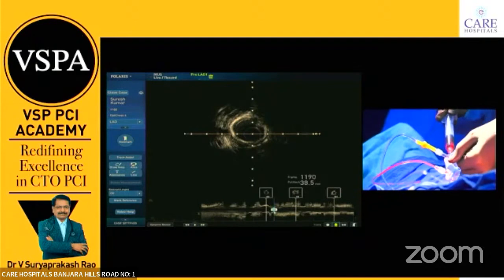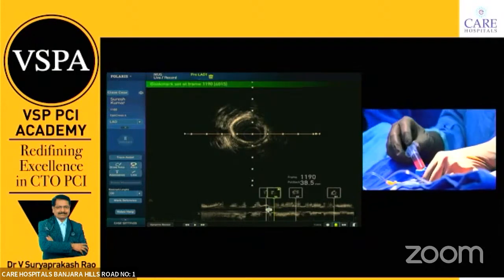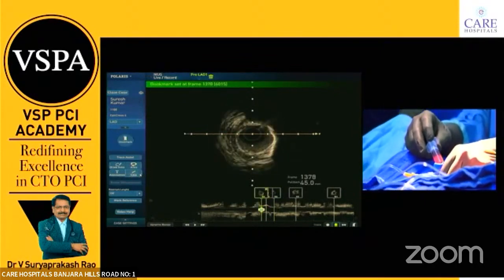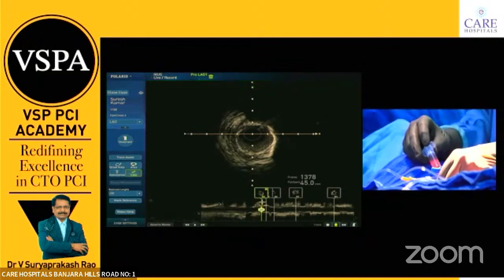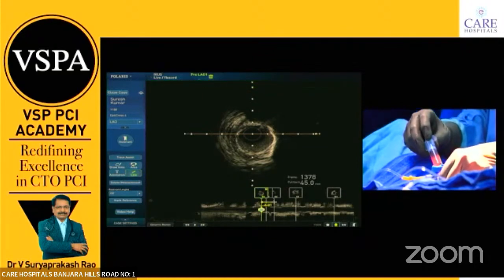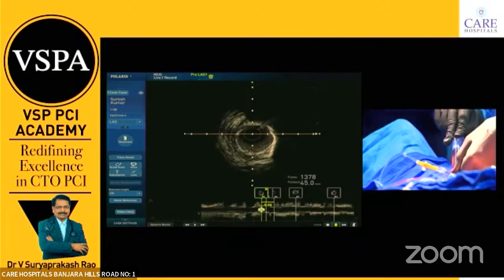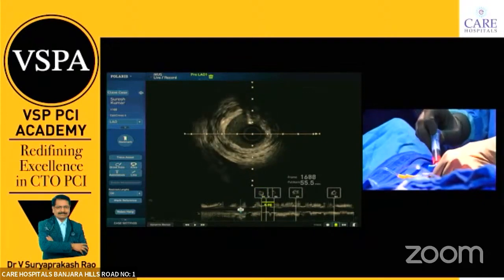If your IVUS is studying the proximal vessel, how much? More than 3. So I will go a little lower, to the middle. I will do an injection and see.